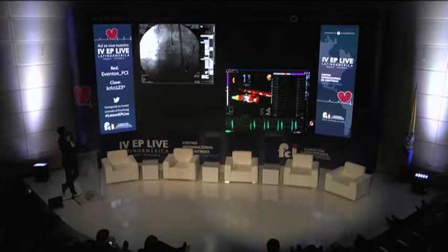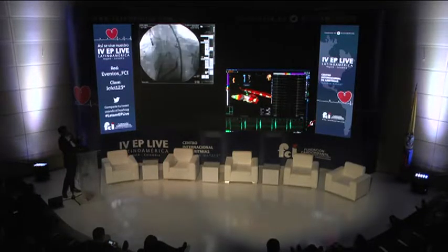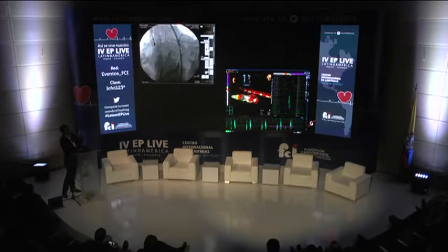So here we are in an intramural sandwich between the endocardic map that Fermin drew, the epicardic map of the anterior interventricular vein, and the wire is just in the middle. We don't have extrasystoles, however. Miguel, let me explain this to the audience. You can see in white the earliest zone of the endocardic map.